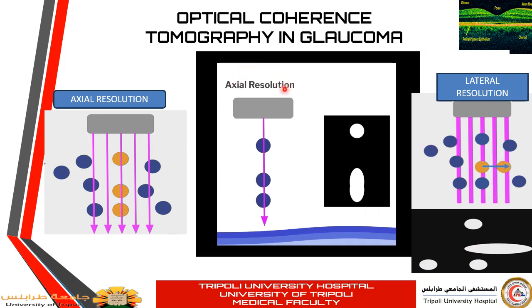Now, as far as the axial resolution, it is dependent on the wavelength of the light source, and the shorter the wavelength, the higher the resolution. And to get a short wavelength, we have to increase the frequency of the rays.